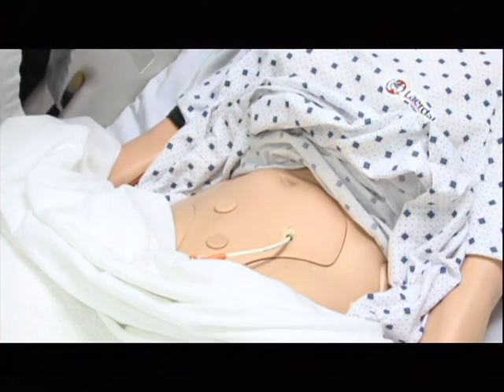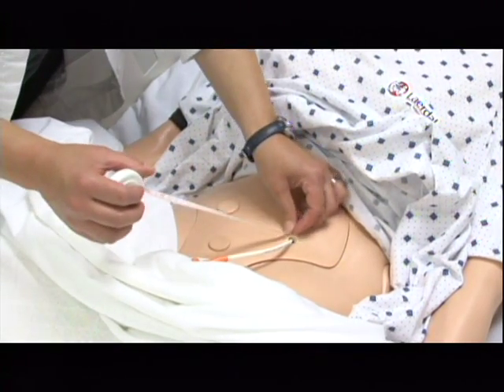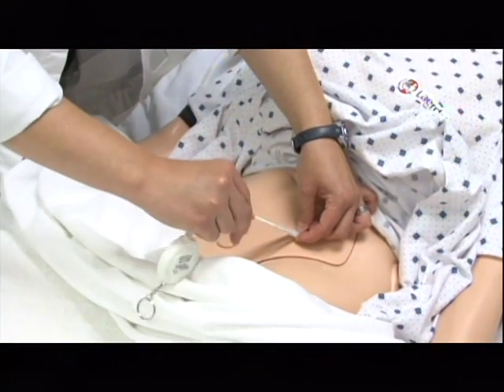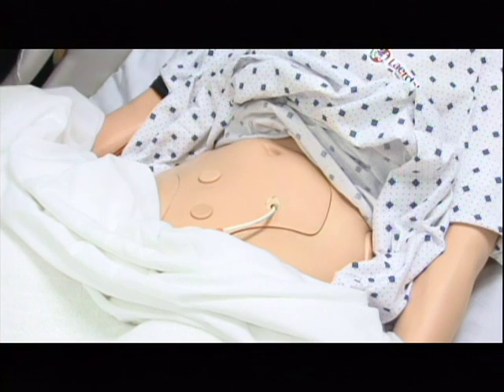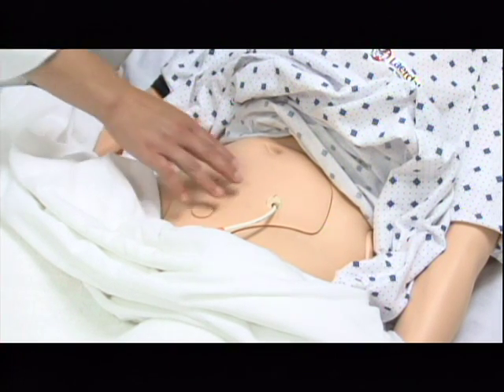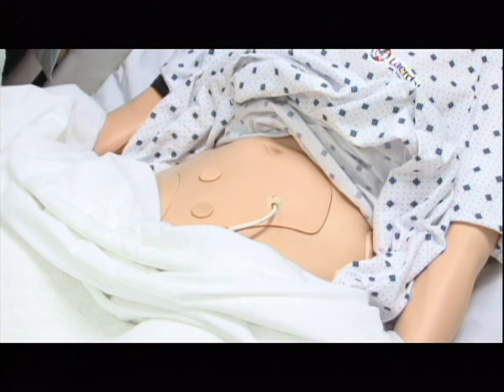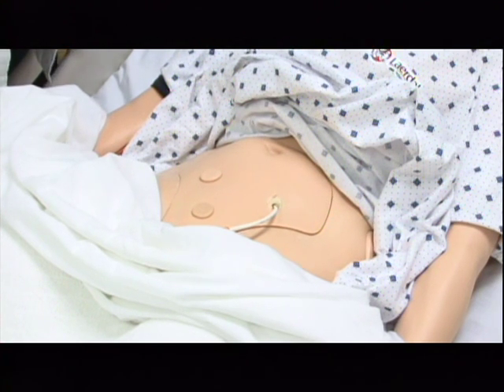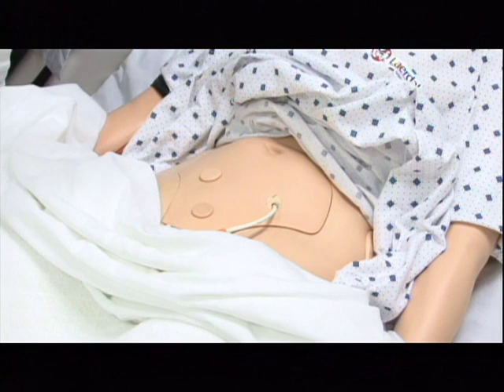As I'm going through this, I've certainly got a tape measure here, and with the gastric tube, I'm going to measure from the level of the insertion site to the actual end of the tube. I would need to make a note of the length and record it in the patient's chart and compare it with any measurements that I had before, also making sure that it does not appear that the tube has migrated any and that the length is the same. One other way to confirm placement is whenever I check for residual, I can check it with the pH paper. One thing you need to remember is that if my patient is getting tube medications or tube feeding, it could potentially alter the pH of the patient's gastric secretion, so you need to be aware of that. So we're going to say that I've measured the length, and this is consistent with what has been predetermined for Mrs. Smith and what the other nurses have found when they've come in and done their assessments.